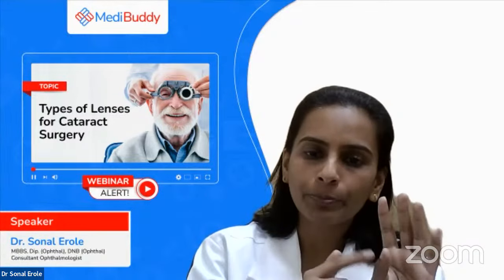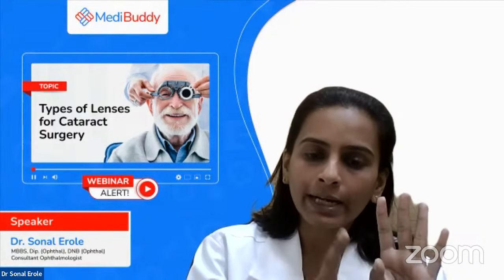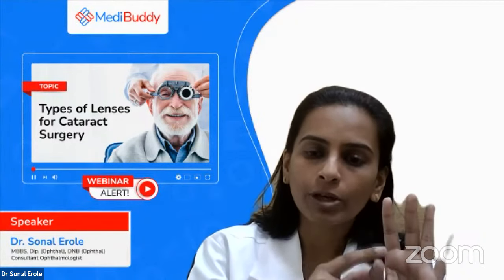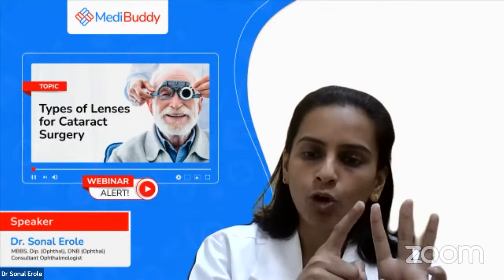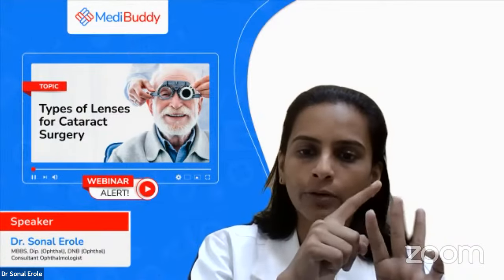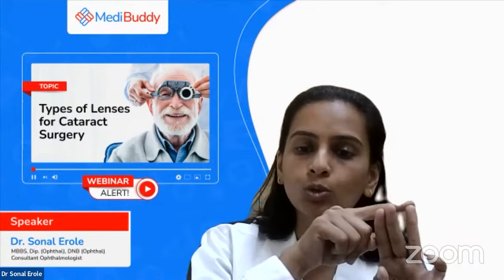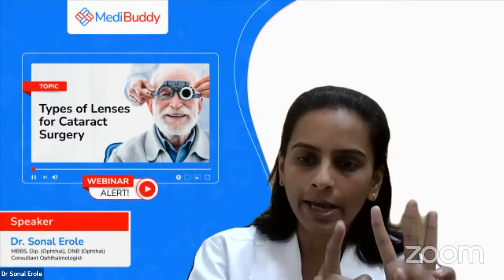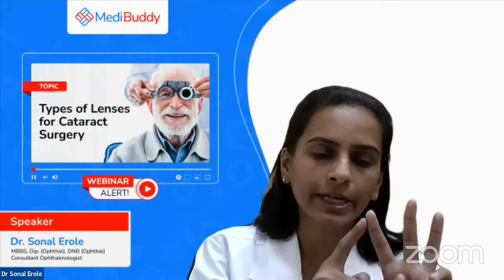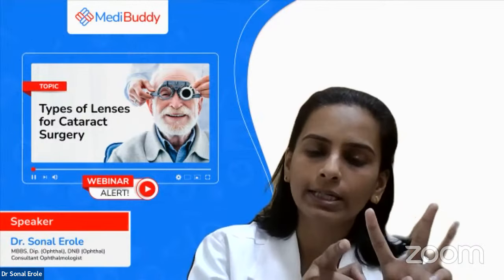So for these patients, after cataract surgery, they will not need to wear glasses, at least for the distance. We have toric options in monofocal, we have multifocal torics, and we have EDOF torics also. So all patients who have cylindrical powers now have options of toric lenses.